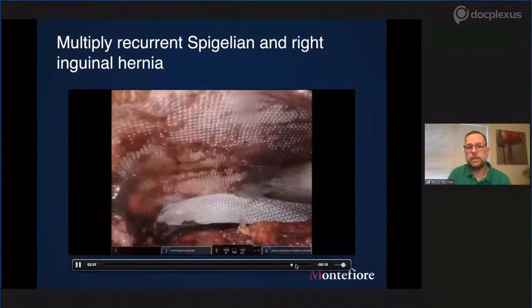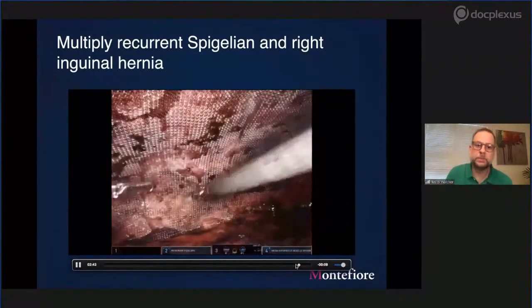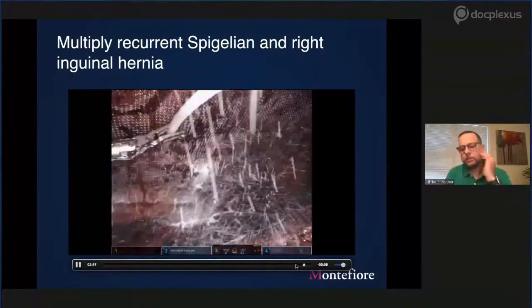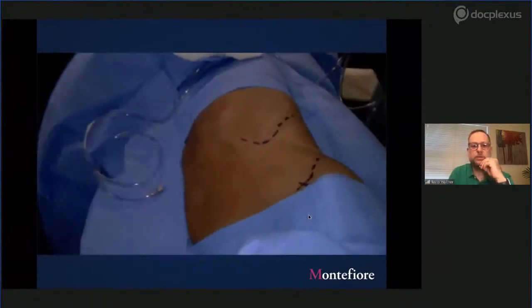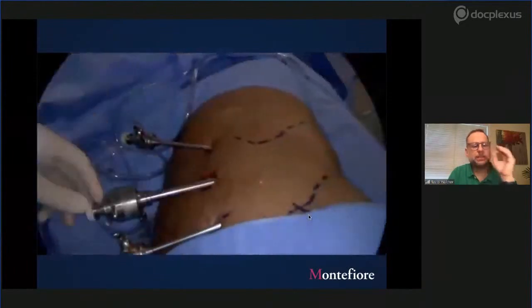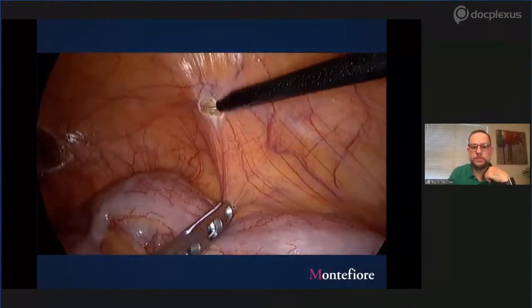in this case a regular polypropylene mesh, with minimum fixation. Posteriorly, you can use some glue fixation. He's tying to the Cooper's ligament, and that's the mesh, a pretty open, wide mesh cover. And he likes Arista for hemostasis and seroma prevention. And to finish this, I want to show another case from Cristiano, just again off midline, a primary lumbar hernia, a Grynfeltt hernia. I think those cases are great for transperitoneal repair or a total extraperitoneal repair, but I think the transperitoneal is easier to accomplish.